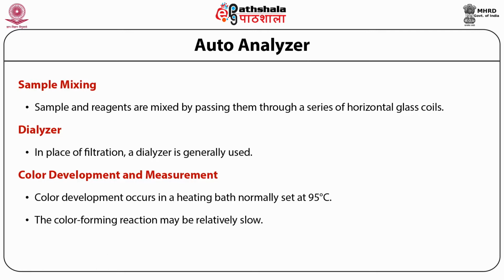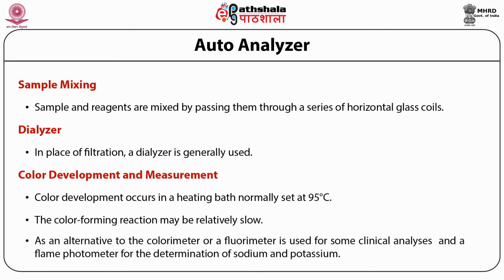From here, the stream flows to the colorimeter and the concentration of the sample component is continuously displayed on a pen recorder. As an alternative to the colorimeter, a fluorometer is used for some clinical analysis, and a flame photometer for the determination of sodium and potassium.